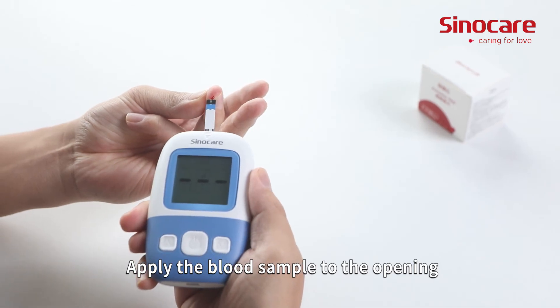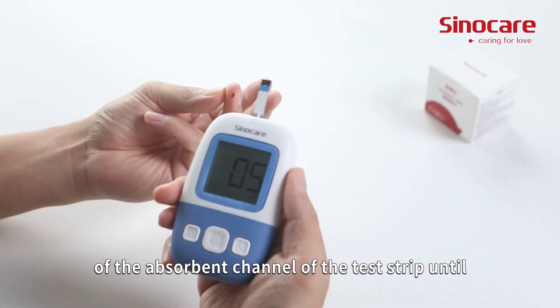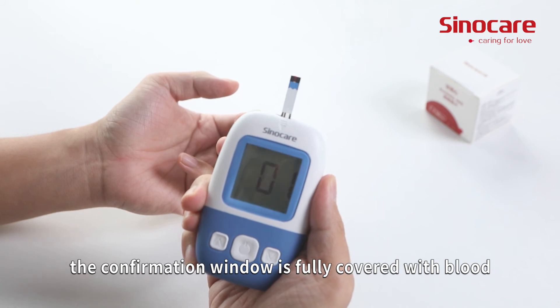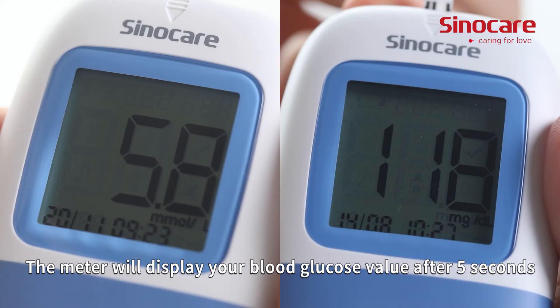Apply the blood sample to the opening of the absorbent channel of the test strip until the confirmation window is fully covered with blood. The meter will display your blood glucose value after five seconds.